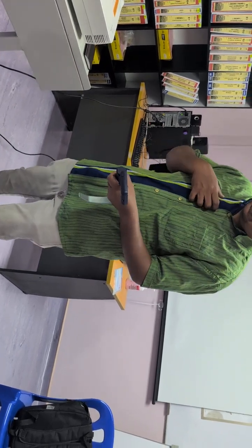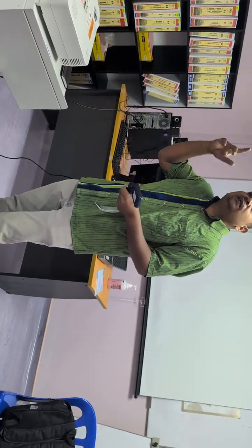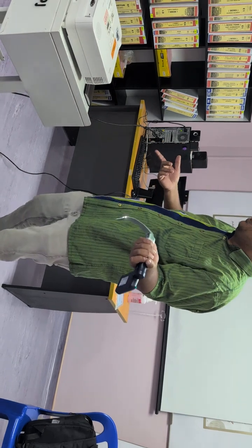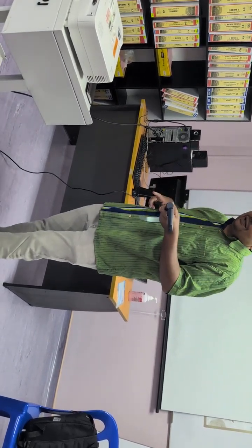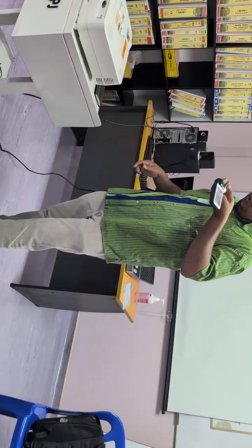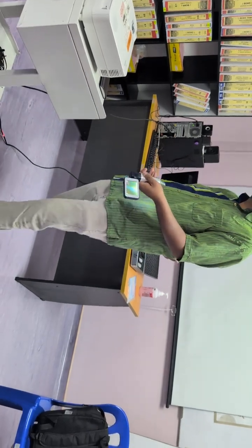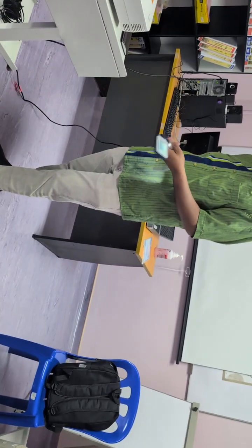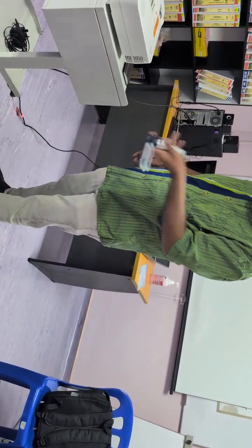So, when we introduce a video laryngoscopy, you need to unlearn what we learned. A video laryngoscopy, you don't usually push the tongue. You go midline, because tongue is not an obstruction to us. Okay? We go midline. So, assuming the camera is here, the moment you introduce, the patient is seeing the camera. Everybody else is seeing the camera but you. Betul? Hence, this moves. You go in midline.